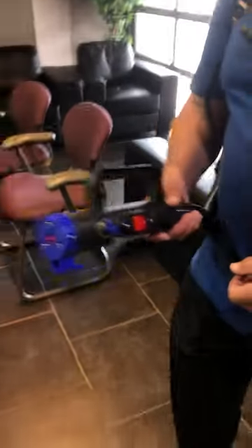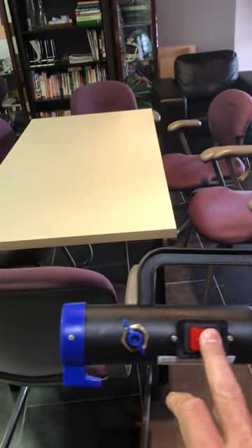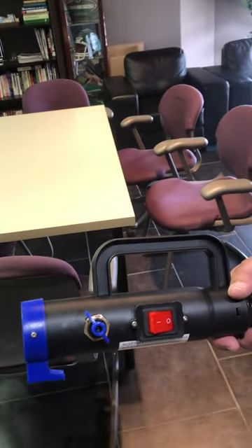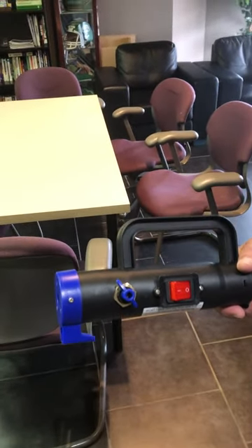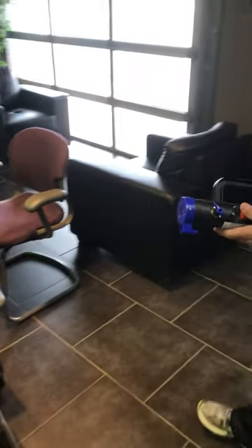I just want to show you a little bit of the valve here. This valve here is your on and off switch, and this valve here is more for the flow of the liquid. You just start with light and see what works for your application — especially inside, you just go light. We'll fire it up here and show you how it sprays.